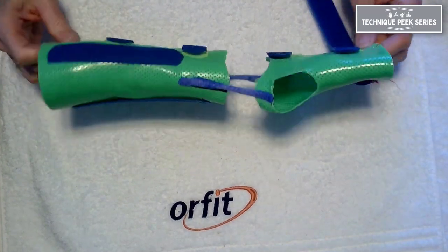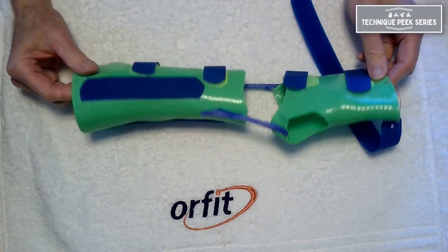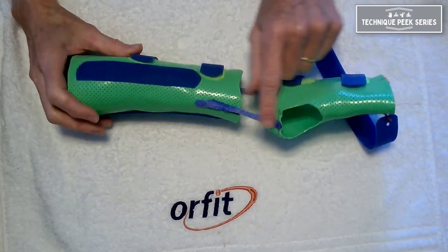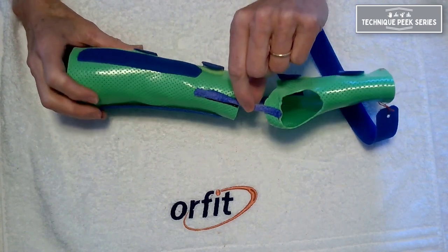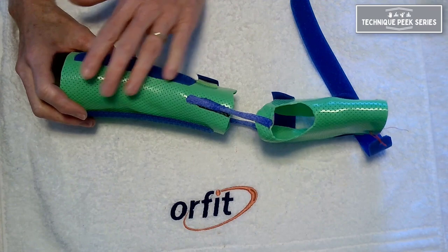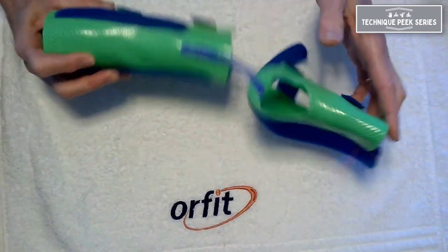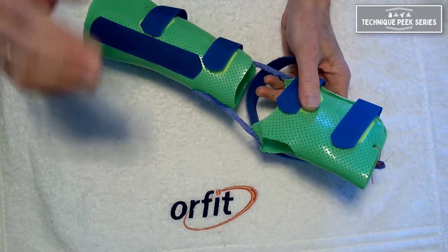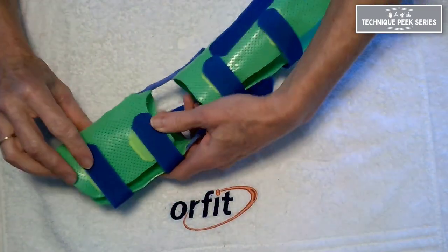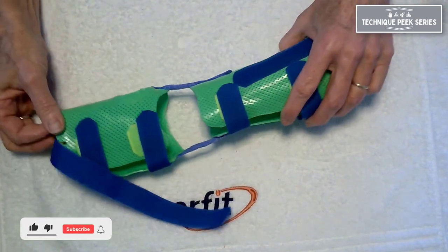Here is a design for a static progressive wrist flexion or extension orthosis featuring OrphiCast hinges — hinges made out of rolled OrphiCast material that connect our proximal segment with our distal segment to allow for ease of motion and no need to establish the correct angle of pull, because we're just working within the wrist's normal joint range.